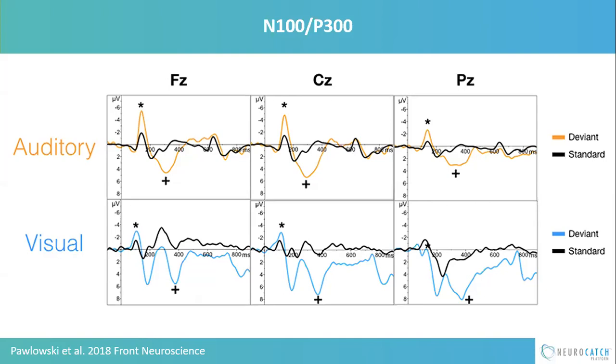Now, move to do the comparison of what happens when we change from giving you information as you hear it to giving information as you see it. First of all, we still get an N1, but now you actually get a very strong P2 component. So notice the N1 move to a P2 and then a P3. This component is not specific to visual, but in this demonstration, it really shows the P2 well. So you might almost consider this as, is this one peak that's bifurcated? It's not, it's actually two separate peaks, and you can really see that clearly under the FZ electrode.